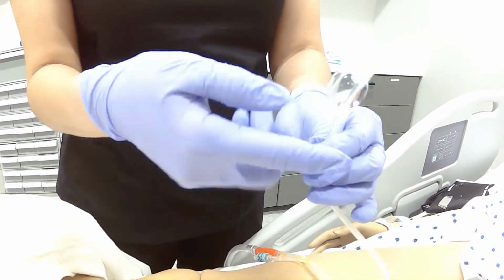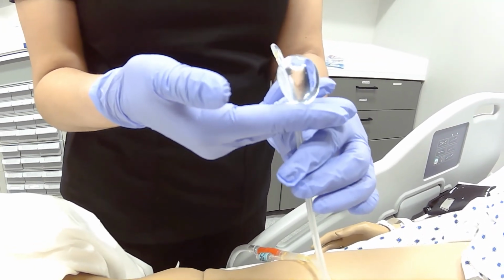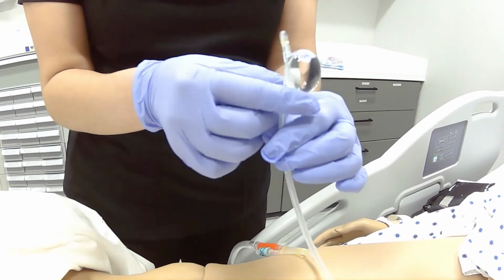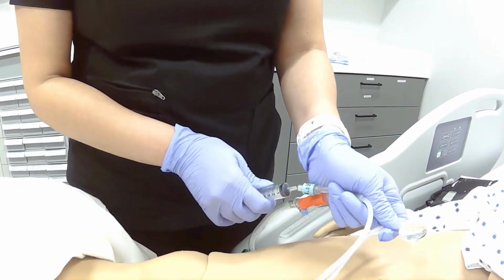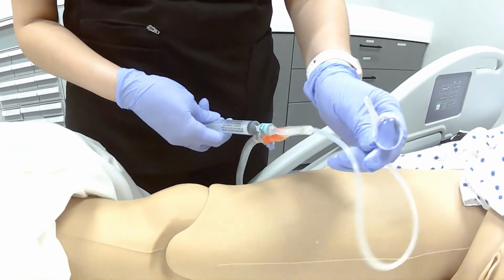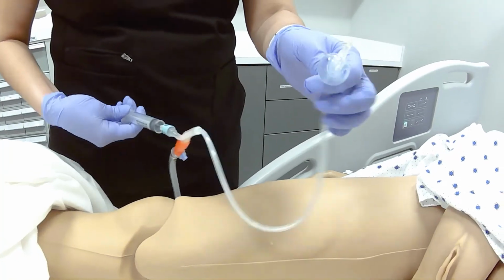There will be times where a patient will self extract the catheter. It could be because they're confused, or because their mental status is altered. Typically patients will not remove it themselves. It can cause urethral damage.